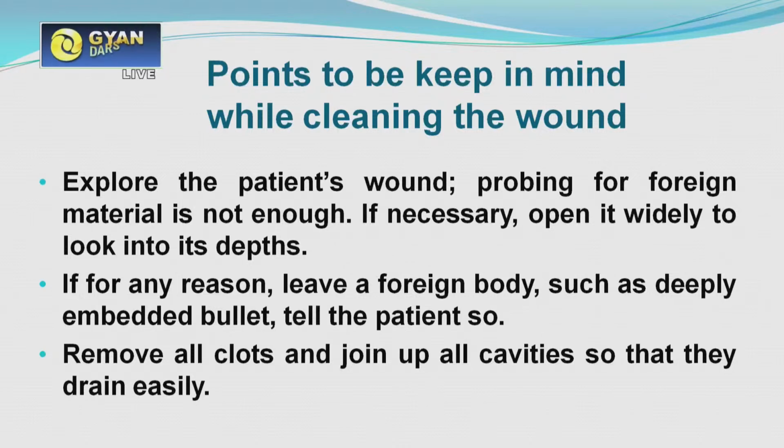Depending upon the facilities available with you and the condition of the wound, do what is possible from your side, because you are not going to give more injury or further infection to the patient, rather you want to manage the wound efficiently at your level.